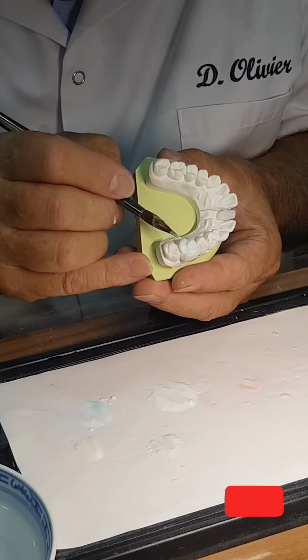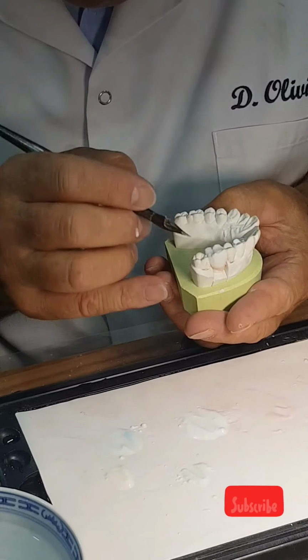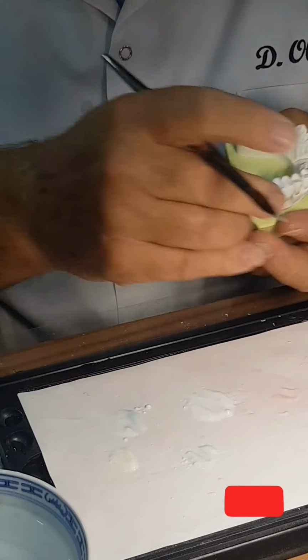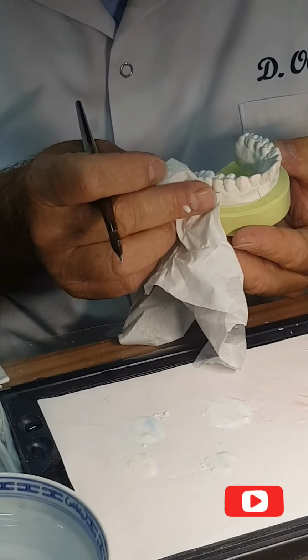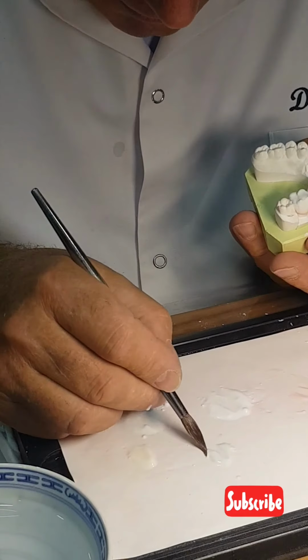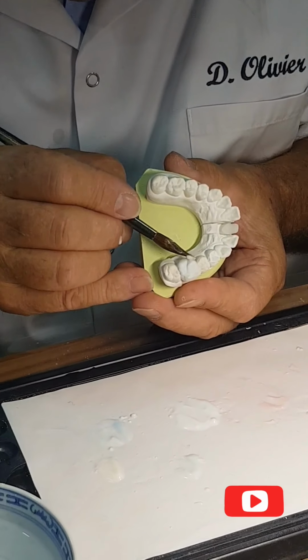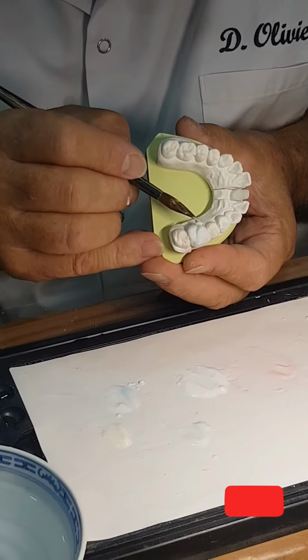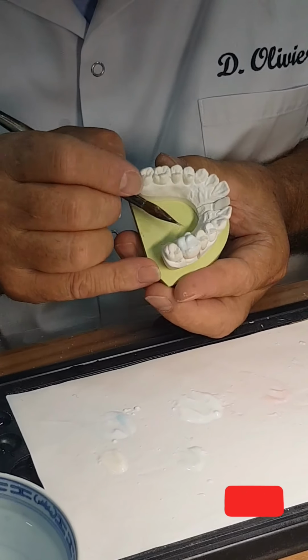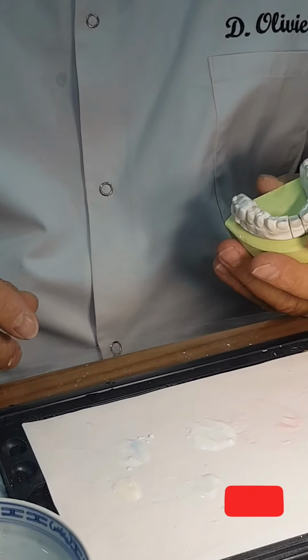Look here. That mamelon here. Larger, downer, always. And we are going to do the Carabelli. Here, very whitish. White. Why not? It's enamel. Carabelli, it's always enamel. Which one do you use, white enamel? Yes, white enamel. Why not?